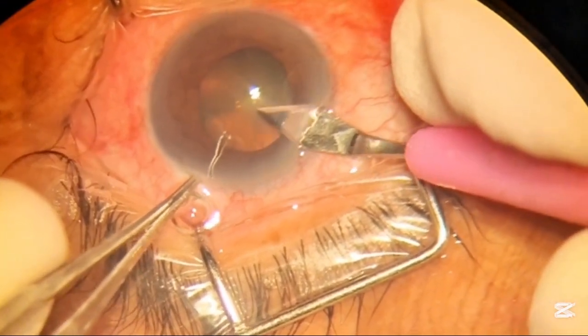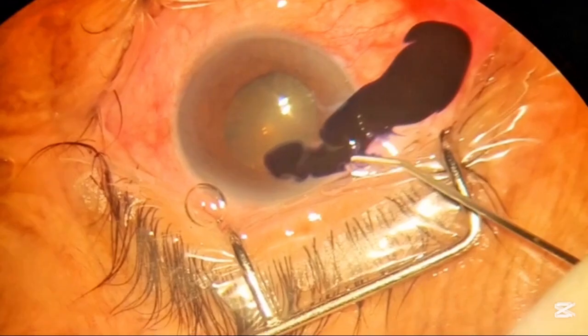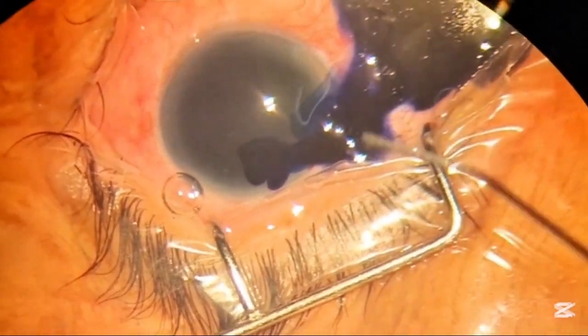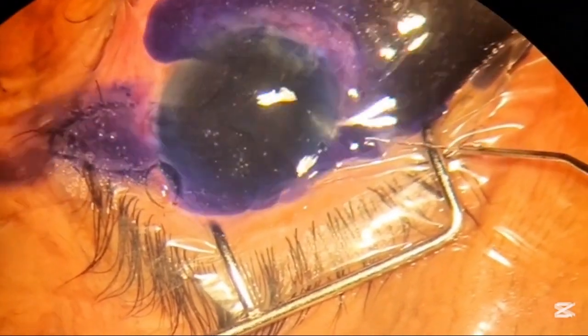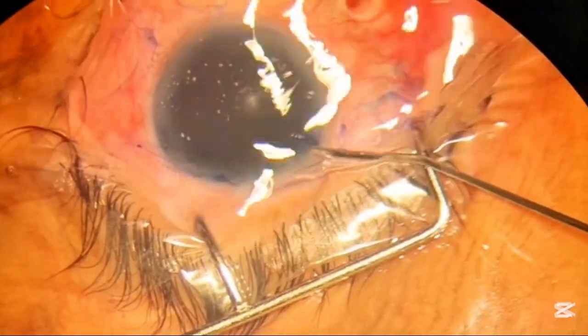So this is a cataract. We are making a 3.2 mm entry port, after which we are staining the anterior capsule so we can see the capsule clearly to perform capsulorexis.